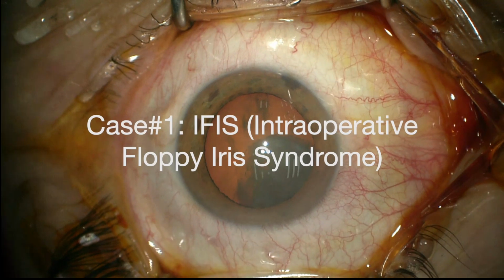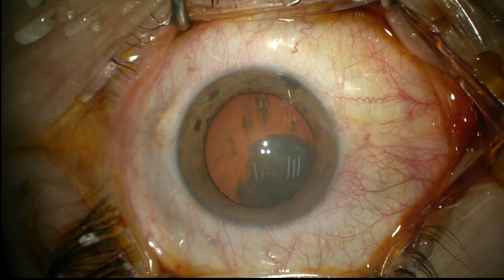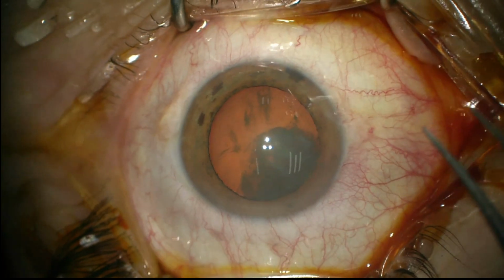This is our first video on the channel focusing on IFIS, Intraoperative Floppy Iris Syndrome. Surprisingly, the pupil is well dilated at the beginning, which is unusual in such cases, and we'll show you a step-by-step approach when this happens in the middle of the surgery. So here is the case.